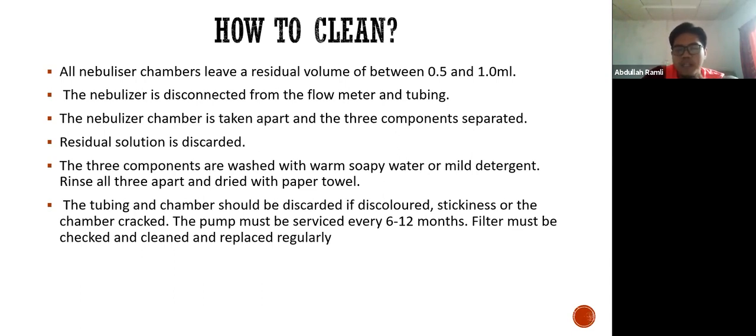The tubing and the chamber, on the other hand, should be discarded if sticky or if the chamber is cracked. The pump, the compressor itself, must be serviced every 6 to 12 months, depending on the conditions. The filter must be checked, cleaned and replaced regularly. So this is basically the general idea of how to clean the nebulizer.